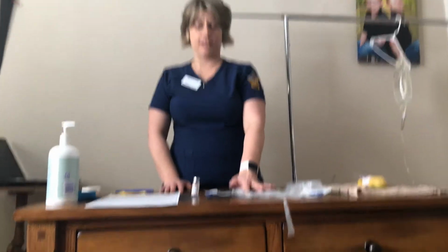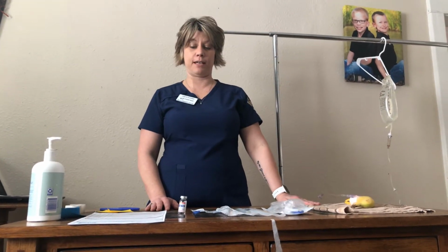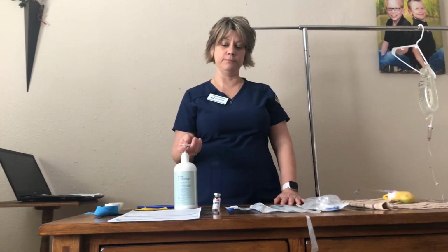Okay, I'm Jenny Hilderman. I'm going to be continuing on with our IV demonstration. I'm going to be adding an IV piggyback for a second medication. All right, I'm going to head into my patient's room, perform hand hygiene. I'm going to make sure I am following the 6 rights of medication.